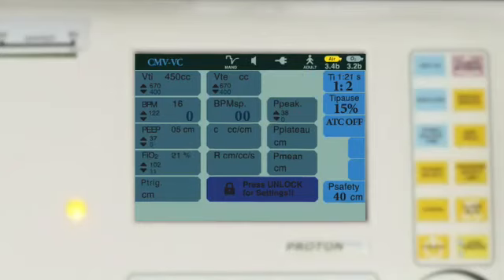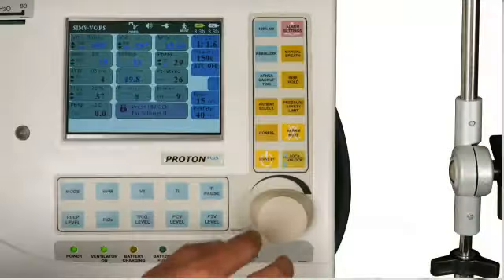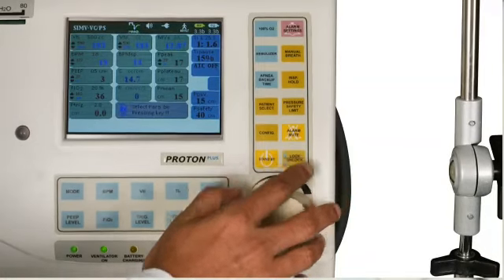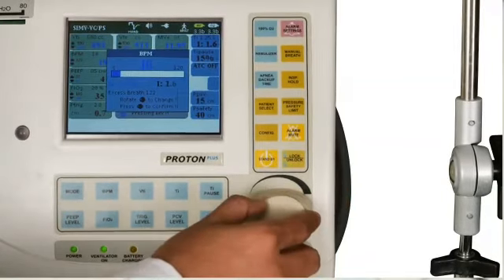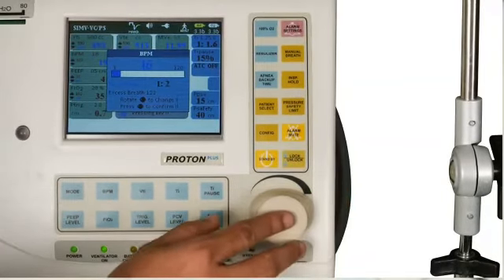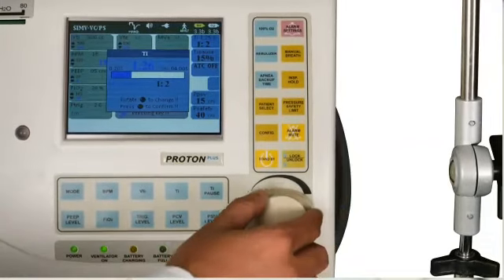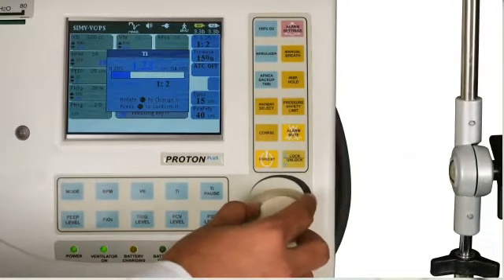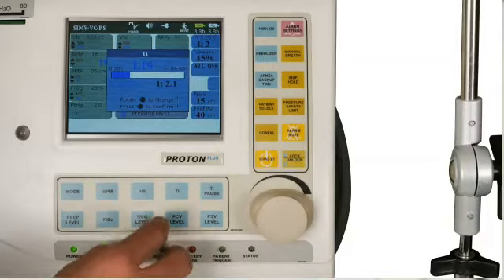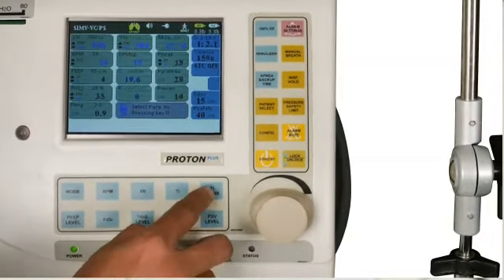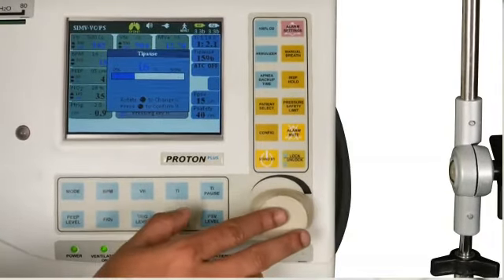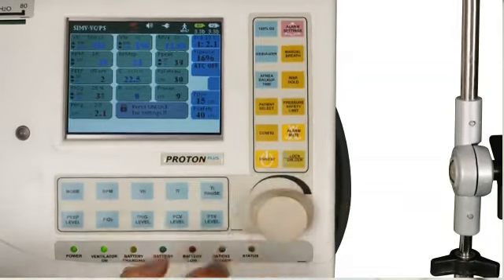There is also a provision to change the mode or parameter while administering the patient on ventilator. It is very simple - just press lock unlock key and you can change the setting by using shortcut keys as per your requirement. This mechanism minimizes errors and enhances accuracy. The shortcut keys also allow you to change the parameter. The operating system is very user friendly.